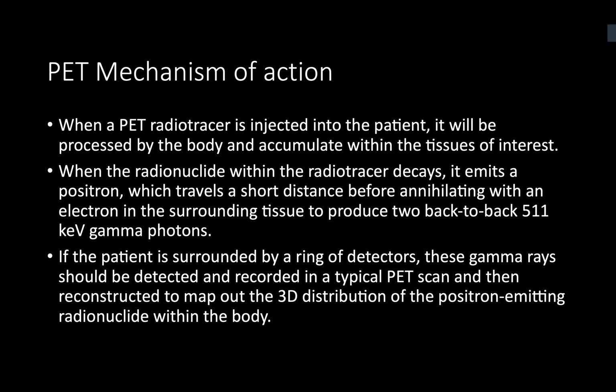How does the PET scanner act? What's the mechanism of action? I don't know. I'm asking because there could be a scenario where the discussion is only on PET scan, because we are utilizing it more and more in prostate cancer. Just like the bone scan, we inject a PET radio tracer. The most commonly used and approved one nowadays for prostate cancer is gallium PSMA, especially in cases of biochemical recurrence. EAU guidelines say that we can use it when the PSA level is more than 0.2.